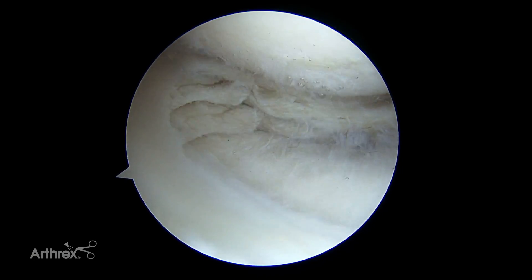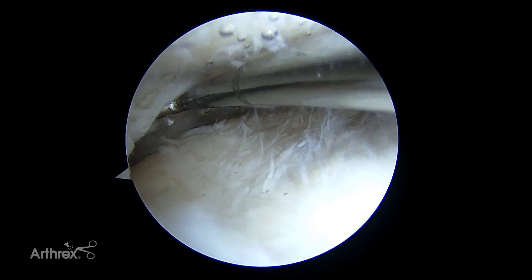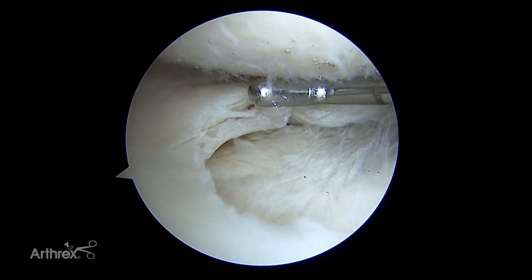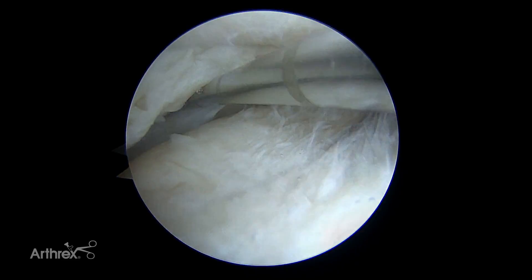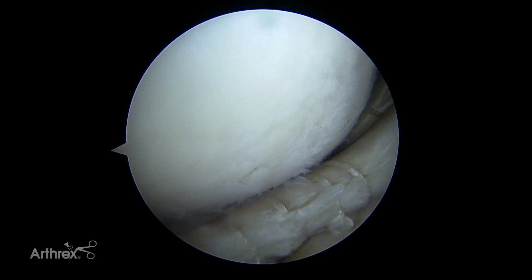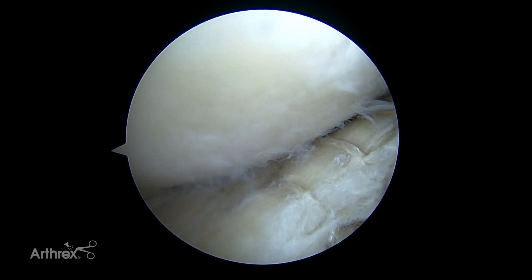When I'm ready I can just cut it. This is another type of circumferential stitch, and we've got a very low-profile knot here at the bottom. This is our final repair — it gives us a nice circumferential repair around this horizontal cleavage tear.